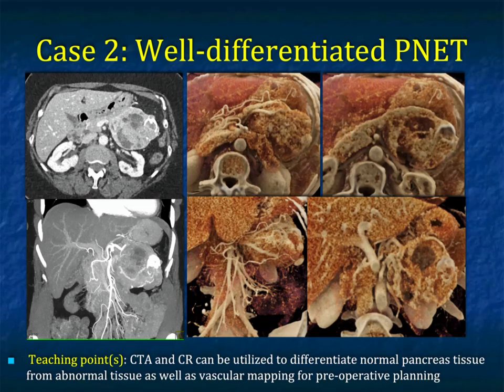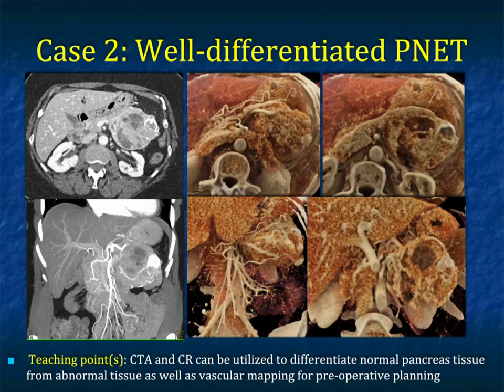Here's a larger tumor at the tail of the pancreas — cystic and solid with calcifications. You can see it very nicely on the cinematic rendering, with some of the neovascularity present. Here we're using a combination of cinematic rendering and CTA to distinguish the extent of tumor, which is very helpful for preoperative planning.